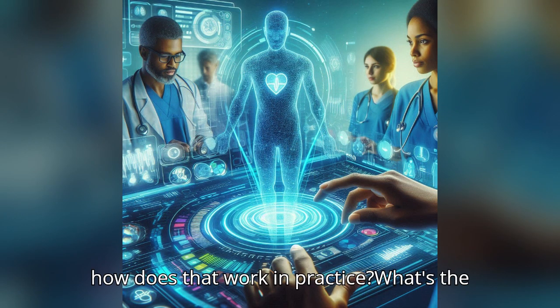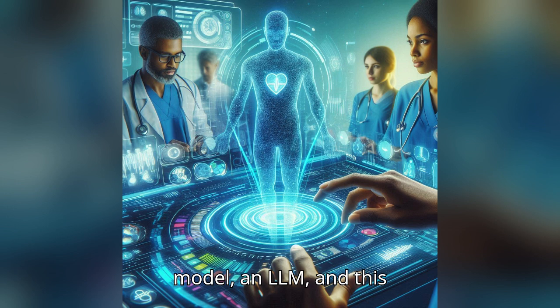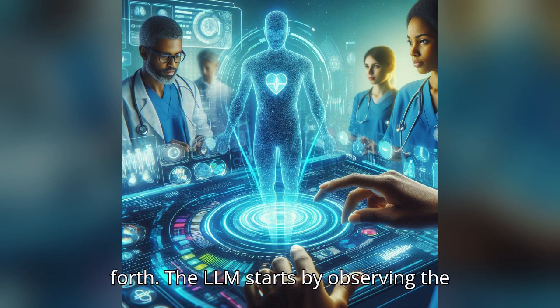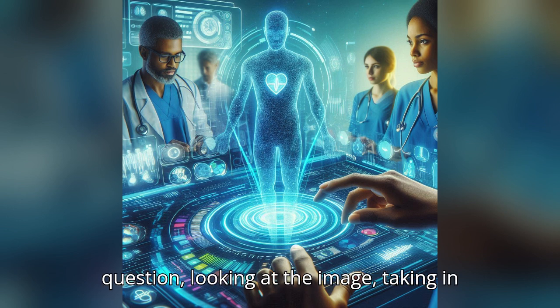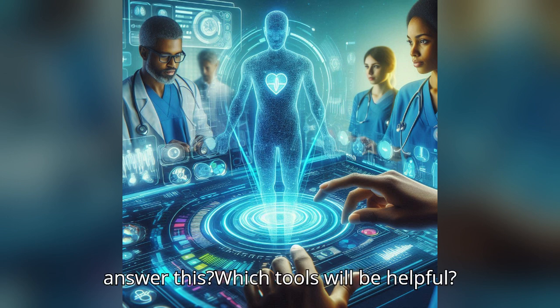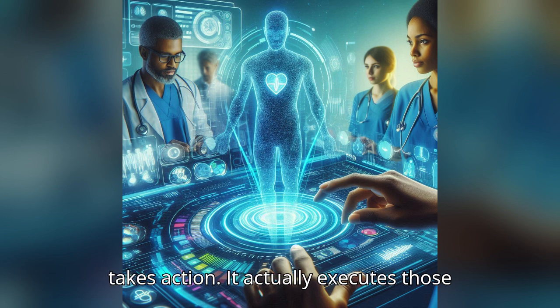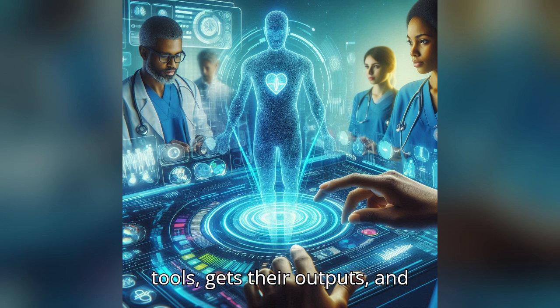Okay, so how does that work in practice? What's the mechanism that allows MedRax to orchestrate all these different tools? At the heart of MedRax is a large language model, an LLM. And this LLM is running what's called a ReAct loop. ReAct stands for reasoning and acting, so it's a constant back and forth. The LLM starts by observing the question, looking at the image, taking in all the available information. Then it thinks, okay, what do I need to do to answer this? Which tools will be helpful, and in what order should I use them? That's the reasoning part. And then it takes action. It actually executes those tools, gets their outputs, and incorporates those findings back into its reasoning process. So it's not just a straight line from input to output. There's this constant loop of thinking and doing.